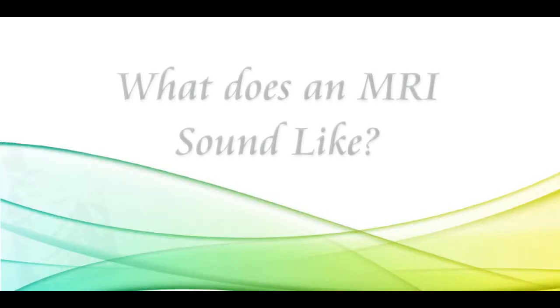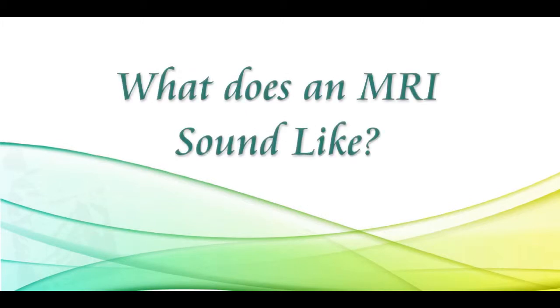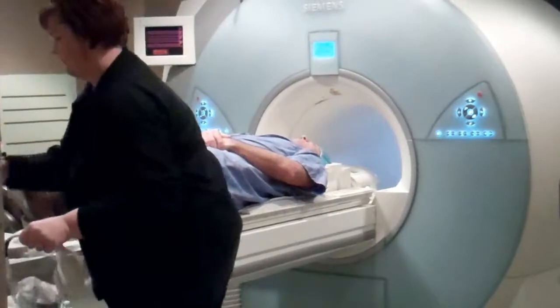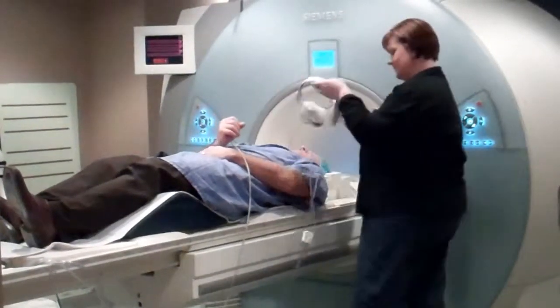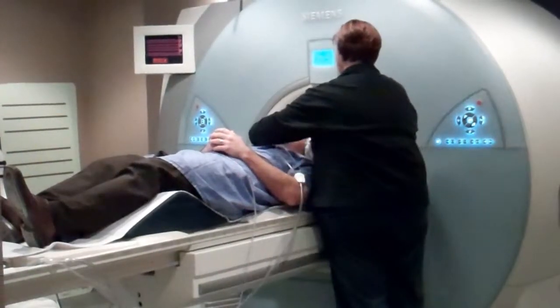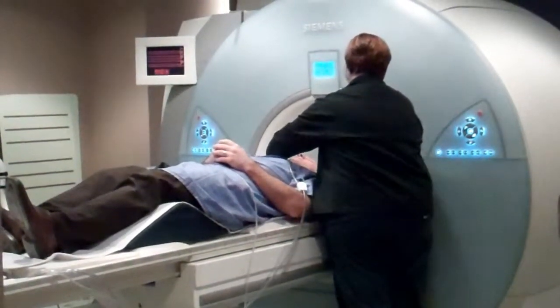After we've gone through the screening form, we explain to the patient what they can expect when they're in the MRI. They are told about how loud the machine is. They're given ear protection and also an alarm ball — if they have any issues while they're in there, they can squeeze the alarm ball. We also, most of the time, provide some type of music for the patient.